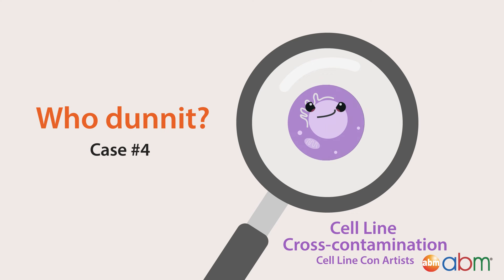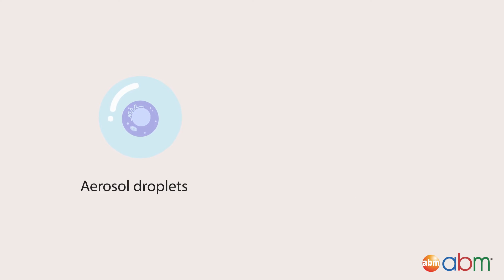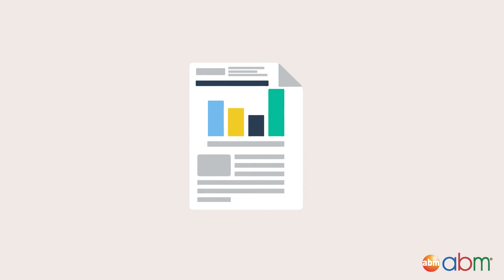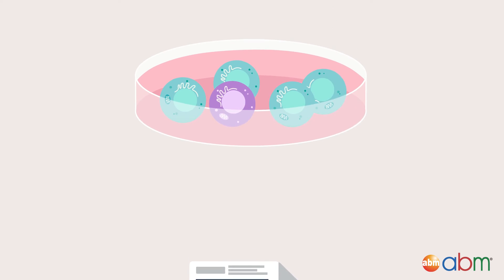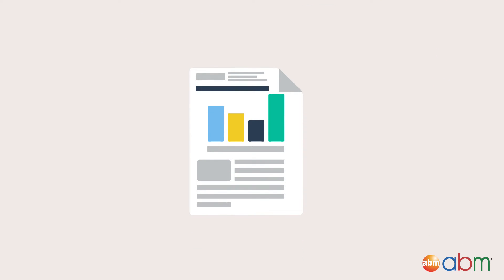Another common type of contamination is cell cross-contamination. This occurs when a different cell line gets mixed in with the desired cells due to cells traveling in aerosol droplets or on contaminated equipment and media. For example, a scientist could be writing up results for an experiment performed on what they thought were human kidney cells, but unbeknownst to them, their sample could have contained HeLa cells that somehow made their way into the cell culture plate. Therefore, their results are no longer valid as the experiment was performed on HeLa cells rather than the desired kidney cells.